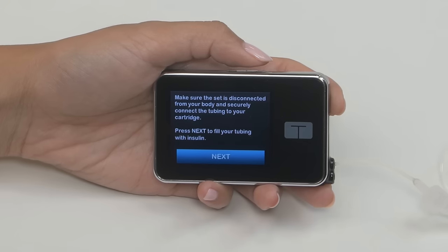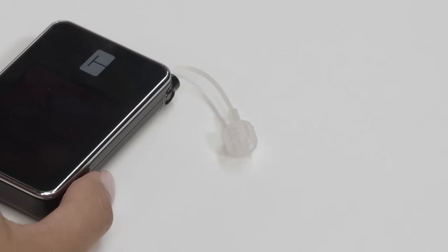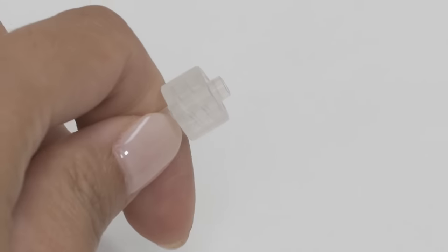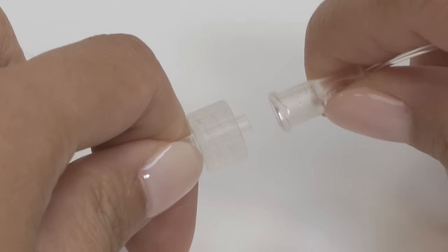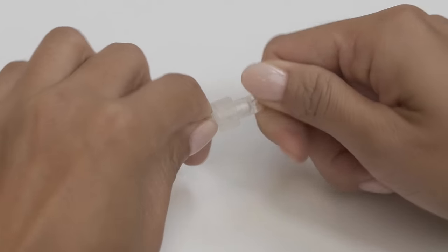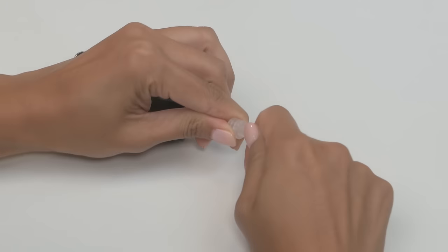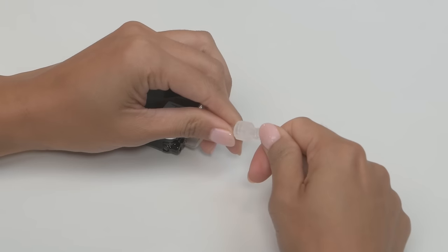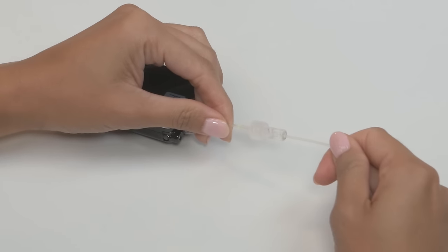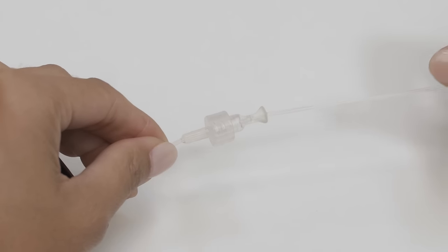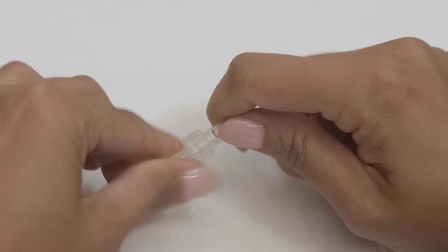Before you can fill your tubing, you need to connect your tubing to the cartridge. Your infusion set may look different, but the tubing fill process is the same. Insert this end into the tubing lock connector on your cartridge and twist clockwise. Make sure it's nice and tight. A loose connection can lead to delivery problems, so it's always a good idea to double check and when in doubt, give it an extra twist.